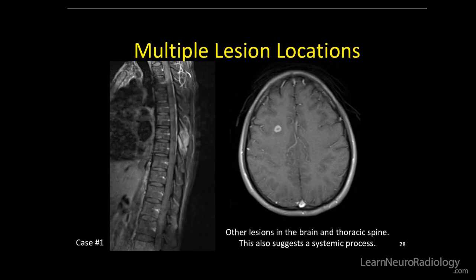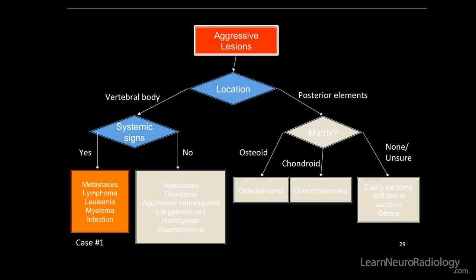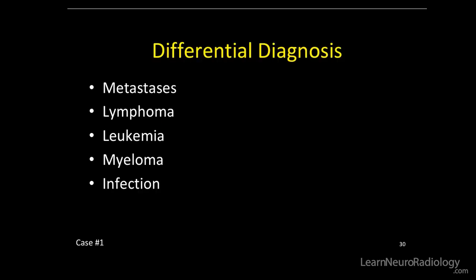The patient also has lesions in other locations — in the thoracic spine and in the brain. So this definitely is a systemic process; it's widespread. That leaves us with the first box, and that's our differential for this case: metastasis, lymphoma, leukemia, myeloma, and infection.